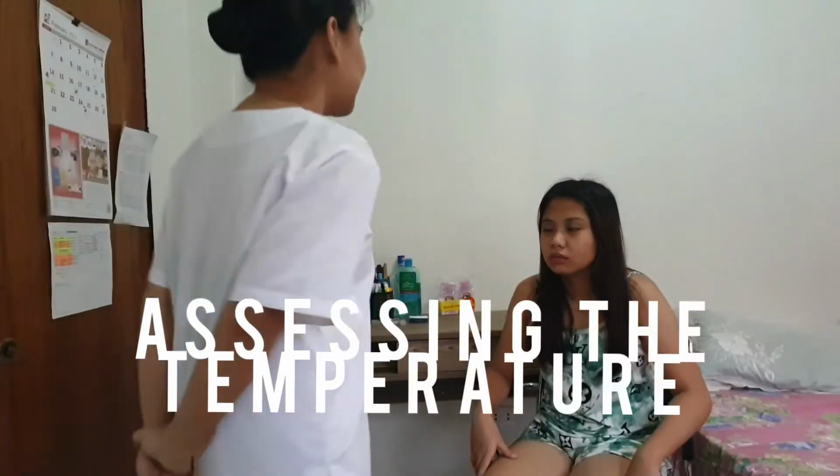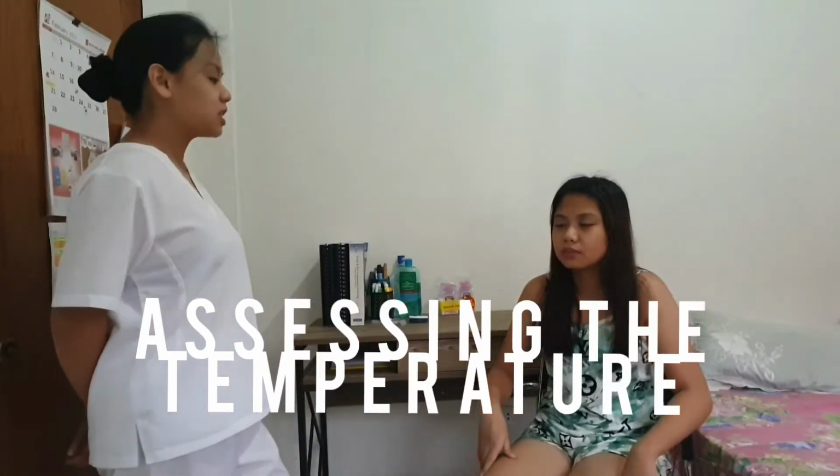Good morning, ma'am. My name is Raquel Hatulan, a first-year student nurse at Davao Doctors College. I will be assessing your temperature today.